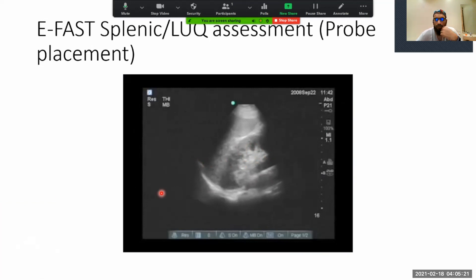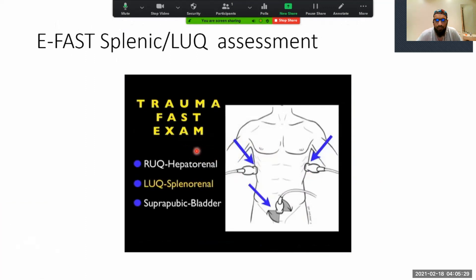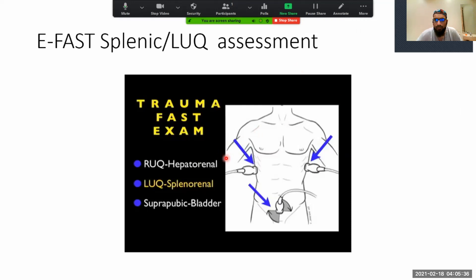That was just to show you how to place the probe — apologies, it got stuck a little bit. So let's move on. Now we're going to actually look at how we do the exam for the spleen and what we're going to see. Let's just try that exam.